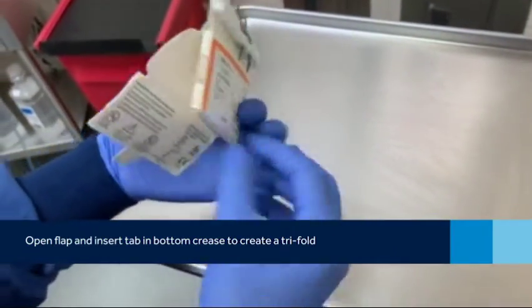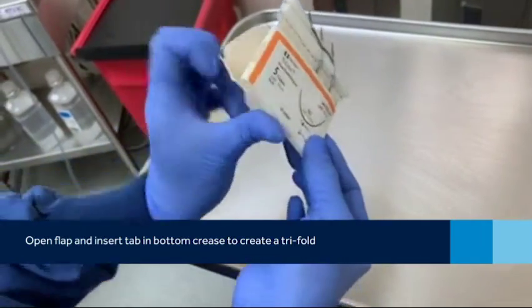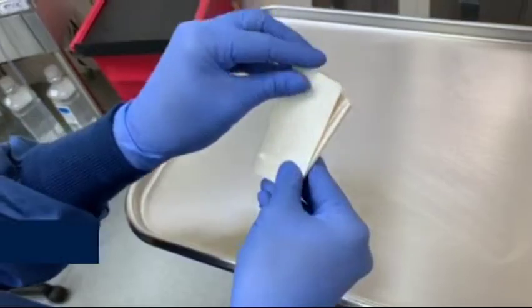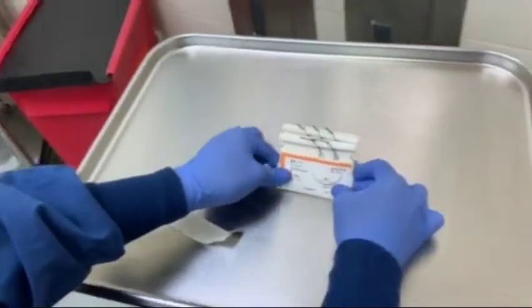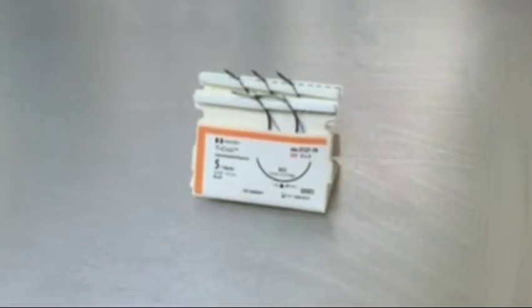Go ahead and flip that around, and then you're going to stick that tab right in that bottom crease, so now it's like a tri-fold. On the bottom here is an adhesive strip. Go ahead and peel that adhesive off, and then you can stick it right there on the table, and it's very, very easy to pass and remove the needles to the surgeon.